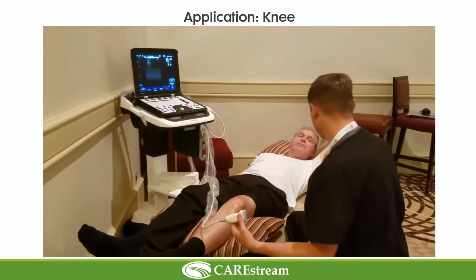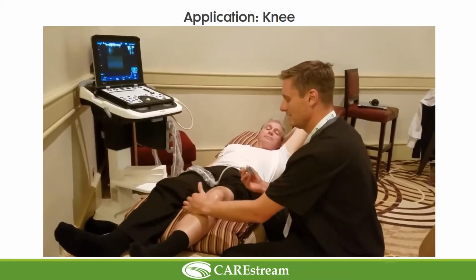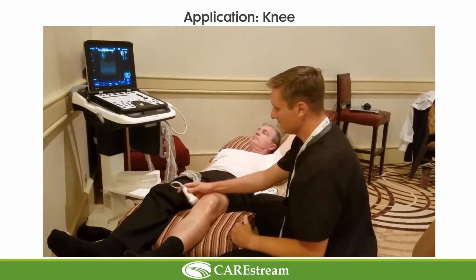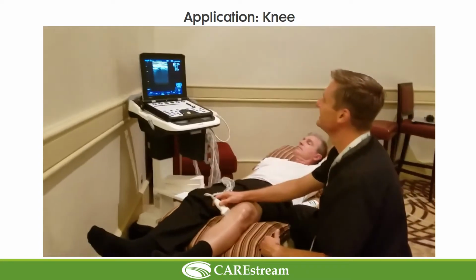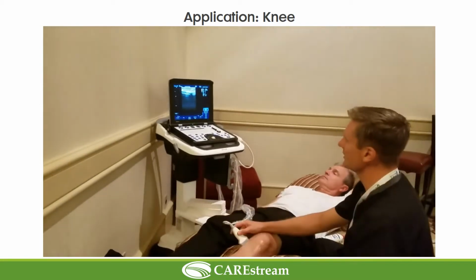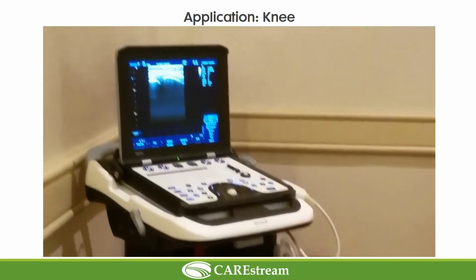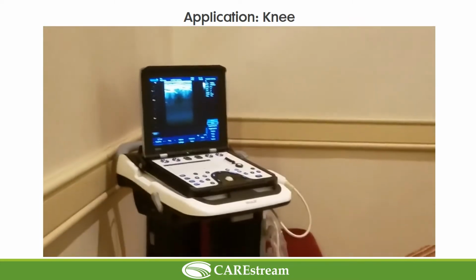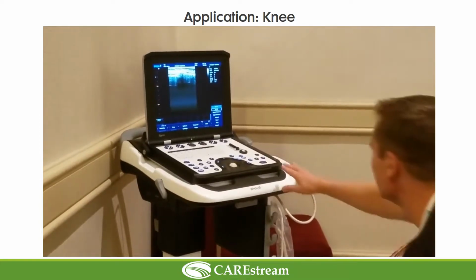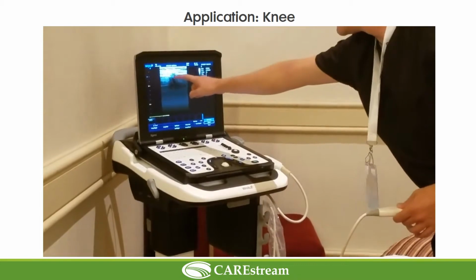The best way to do the medial meniscus, in my opinion, is you're going to put the knee on the side, basically at the midpoint of the knee. You're going to find you're a little high most of the time. It's actually just a little bit below the midpoint of the knee. So if you put it on there, try drawing your probe down just a little bit, and it'll show up most of the time. So that's actually your medial joint line right there on the screen. And the space in between, there's a gray space in between. I think it looks kind of like an ice cream cone. That's your medial meniscus.